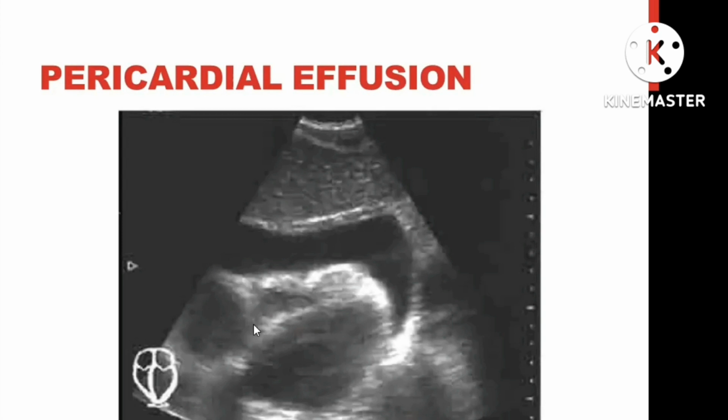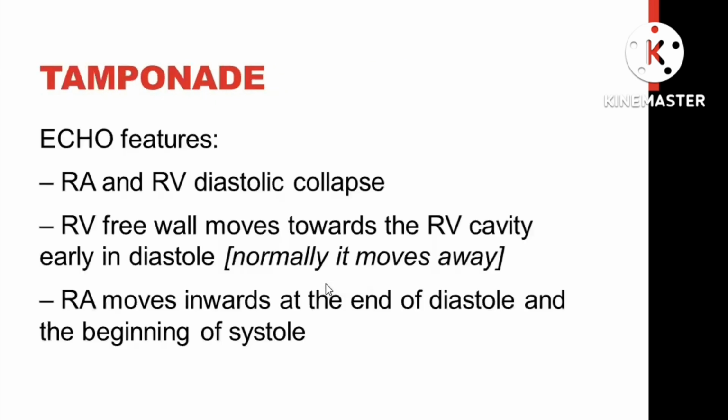The problem is the view, okay? Yeah, it is the view. Okay, so the fluid is significant, right? So you can measure it. It looks more than. Okay.